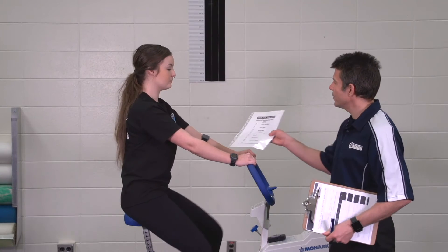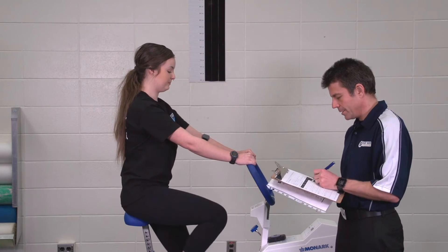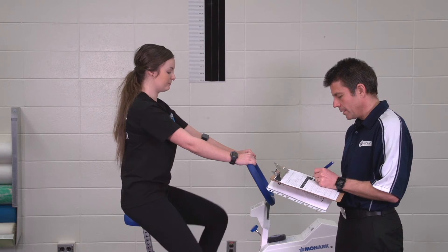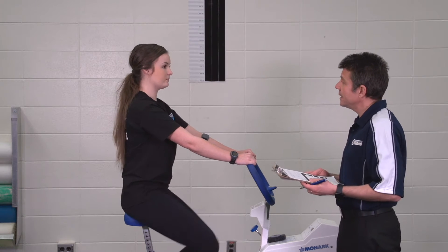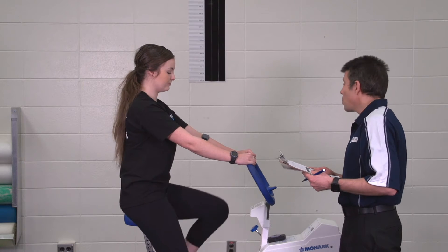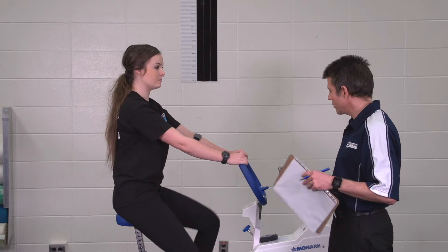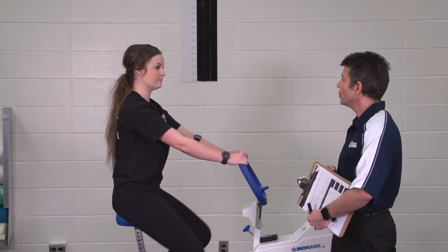I'm also going to ask you how difficult this is. Nine out of 20. Your heart rate is in a steady state, which is defined as less than five beats per minute change. So based on the heart rate recorded for the last two minutes, I'm going to increase the resistance on the bike to 2 KP.